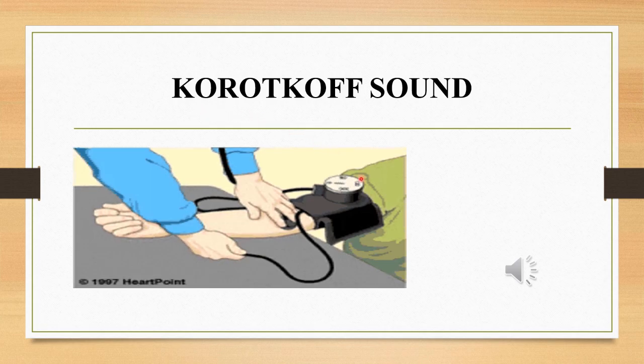Okay. So when the sound begins, that reading will be your systolic blood pressure, and where you fail to hear the sound or where the sound stops, that is your diastolic blood pressure.